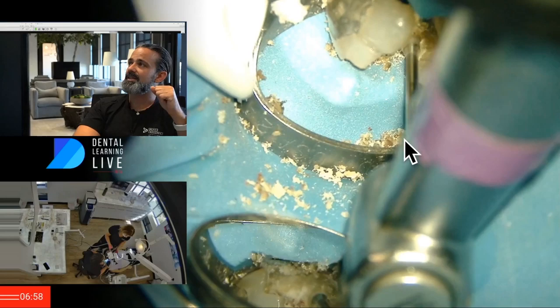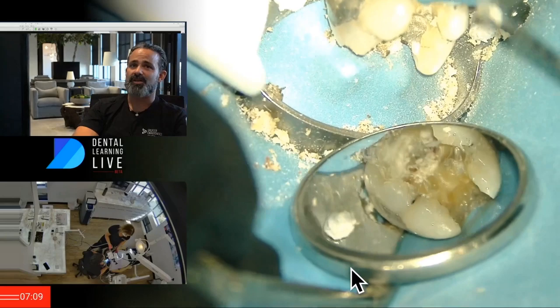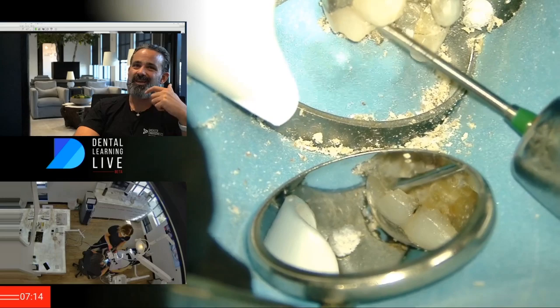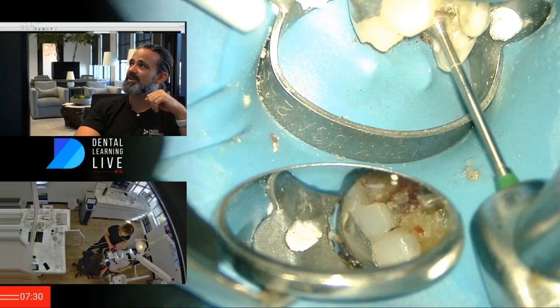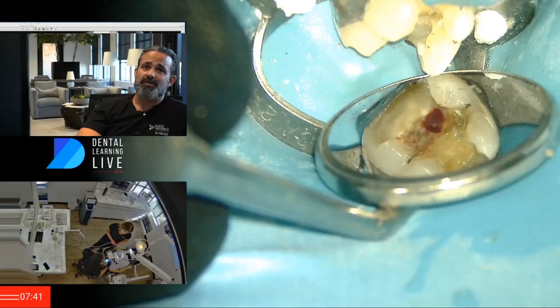By removing the decay, I can already see a little twinge of red — I've already kind of entered into the pulpal anatomy space. In another video I showed how to address a pulp exposure with your sound seal. When it's like this and the pulp is atrophied or not that hyperemic, a lot of times I'll just leave it and go right over the top. But right now I'm just going to get the decay out, because if I try to use sound seal on infected dentin it doesn't stick as well. When you get down to more healthy dentin, it sticks better.